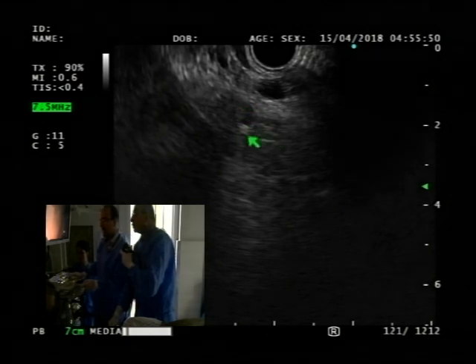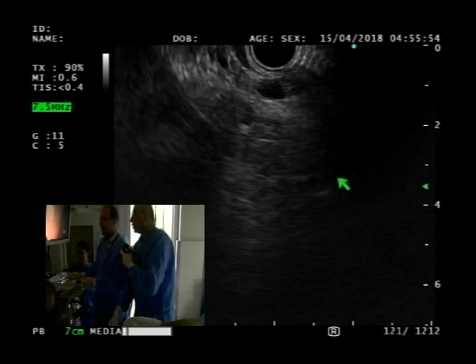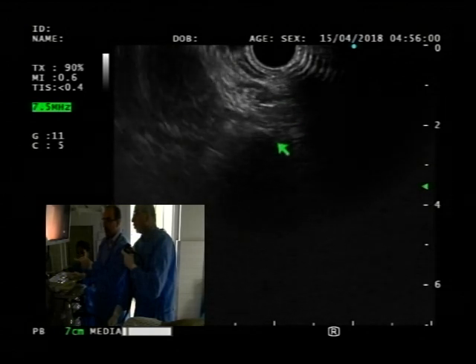Right, the seagull appearance. See that? And then the kidney is on your left on the screen. And then the spleen would be down here. Now that you follow the pancreatic duct, there's your adrenal. You're sitting right on it. And that's the spleen there.